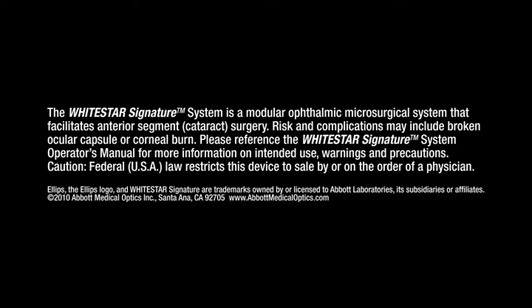The White Star Signature System is a modular ophthalmic microsurgical system that facilitates anterior segment or cataract surgery. Risk and complications may include broken ocular capsule or corneal burn. Please reference the White Star Signature System Operator's Manual for more information on intended use, warnings, and precautions. Caution: Federal USA law restricts this device to sale by or on the order of a physician.